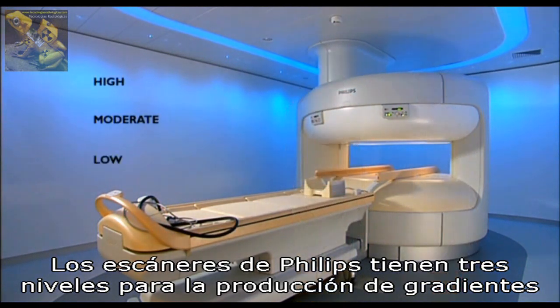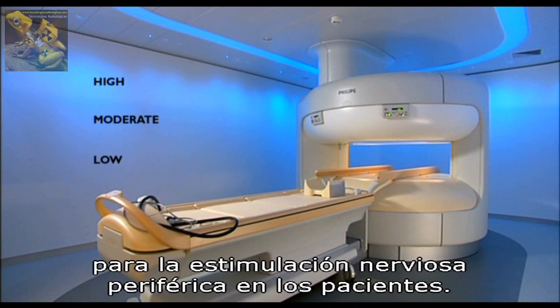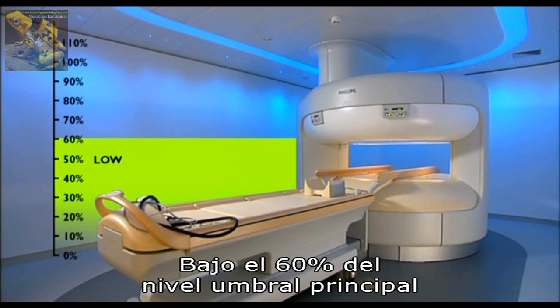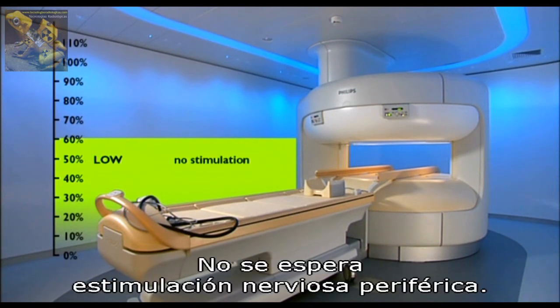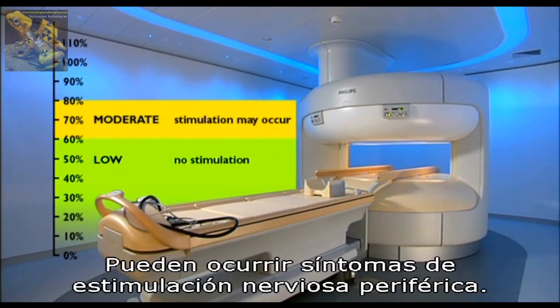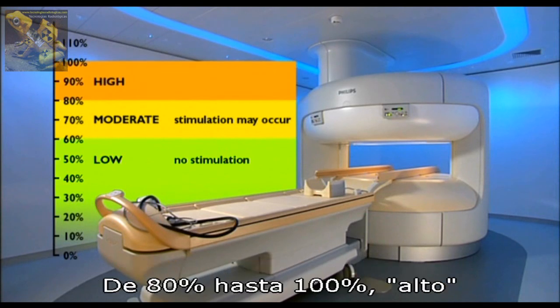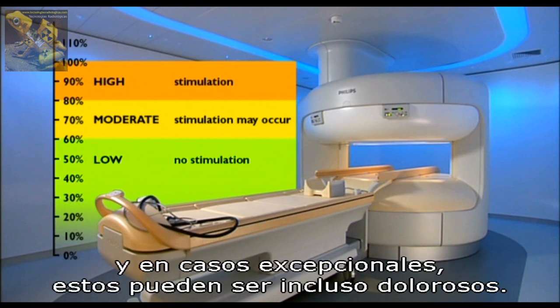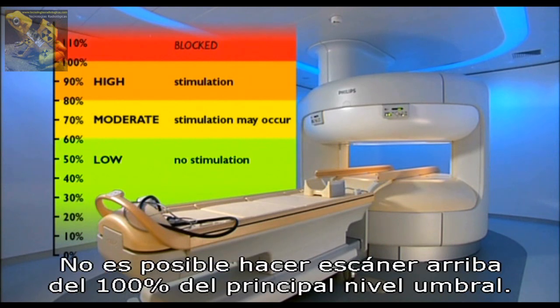Philips MR scanners have 3 levels for the gradient output, related to the mean threshold level for peripheral nerve stimulation in patients. Below 60% of the mean threshold level, low, no peripheral nerve stimulation is to be expected. Up to 80%, moderate, peripheral nerve stimulation may occur. From 80% up to 100%, high, peripheral nerve stimulation is more likely to occur, and in very exceptional cases can even be painful. Scanning at levels above 100% of the mean threshold level is not possible.